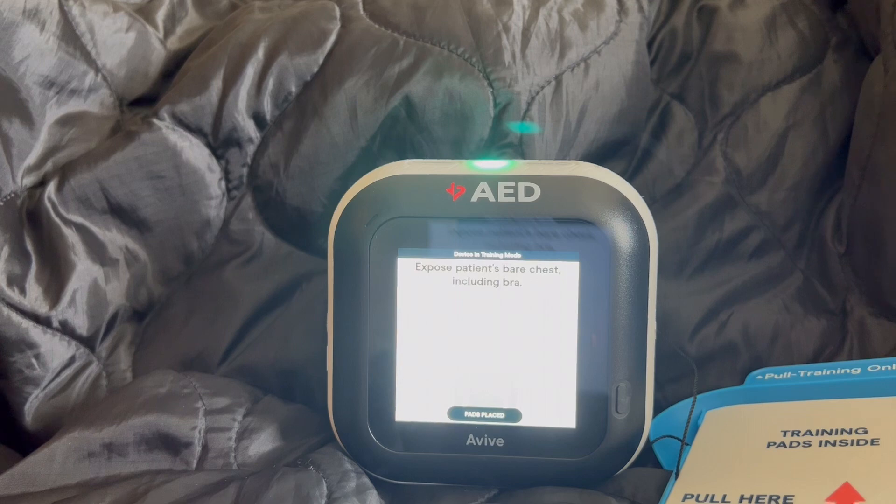Expose the patient's bare chest, including bra. Once the patient's chest is exposed, peel open the package you pulled from the device and take out the pads inside.